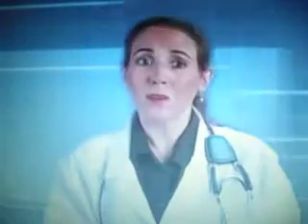We all know that only part of a solid medical education occurs in the classroom. Real patients require real diagnostic ability, and in addition to its prowess as a classroom teaching device, the CardioSim system can be extended outside of the classroom to provide benefits in a patient setting as well.